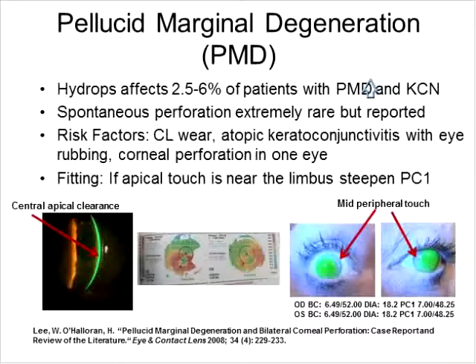Okay, here's a good question. Have any of you dealt with fitting sclerals following cross-linking? And if you have, what period of time do you wait before starting the fit? And have you found that changes continue to occur to the cornea affecting the fit even after the fact?